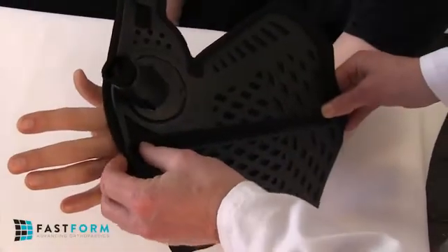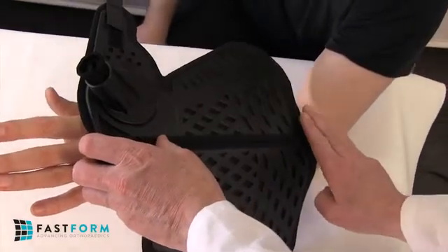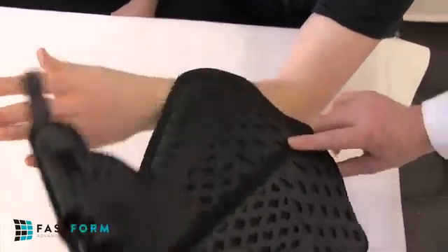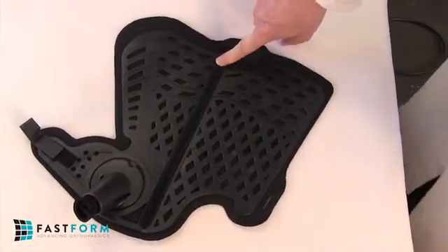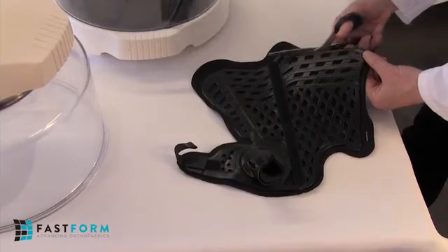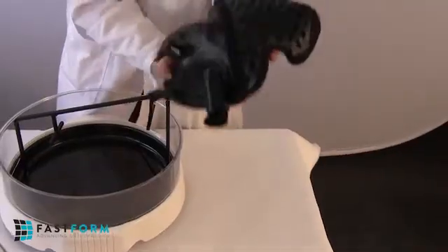Prior to heating, to gauge a suitable length for the thumb spica, place it on the patient's arm, aligning the radial hinge along the radius and the distal dorsal end parallel to the knuckles. Typically, a distance of approximately 50 mm or roughly 2-3 finger-breadths should be left between the thumb spica's proximal end and the elbow's crease. If the thumb spica requires shortening, take note of the amount required as trimming is easier to do when the polymer is soft and malleable after heating.